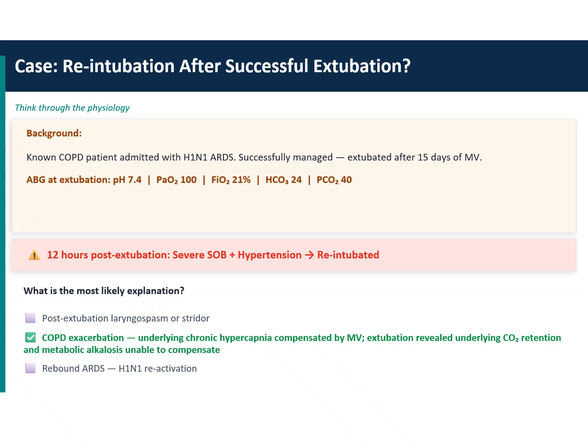The problem again is sometimes people are taken onto pressure supports of 20-25. That actually tells you the patient is not ready for weaning. If someone is requiring a pressure support of 20 or 25, that's important to understand, because these high volumes delivered with pressure support can actually cause diaphragmatic dysfunction. So that will actually delay the extubation.